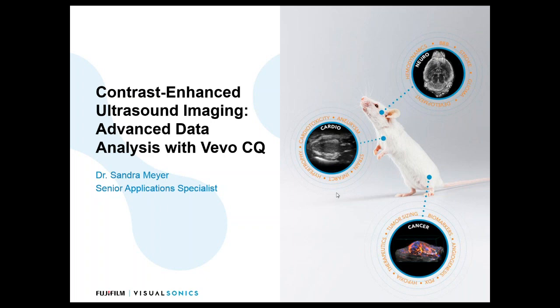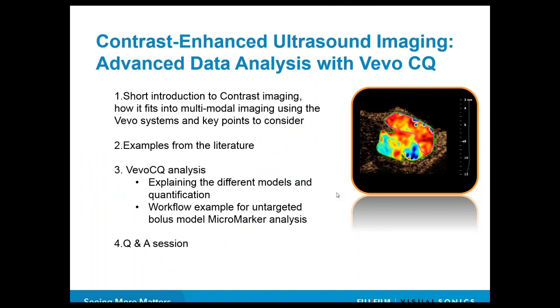The outline of today's webinar is quite simple. We start with a short introduction. I said short when we set up this webinar, but going through the data, I realized that we really didn't have a real contrast webinar for quite a while.